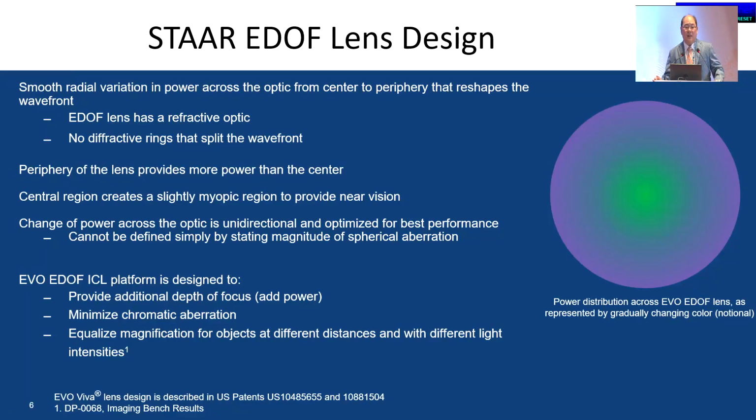So it adds a little bit of depth of focus, and it takes advantage of the reflex of the eye wherein when you accommodate to read near, your pupil becomes smaller, so you're looking through the add part, and then when you look at distance, you're looking at the distance part, similar to your EDOF or monofocal plus IOLs now in the market. So similar principle as that.